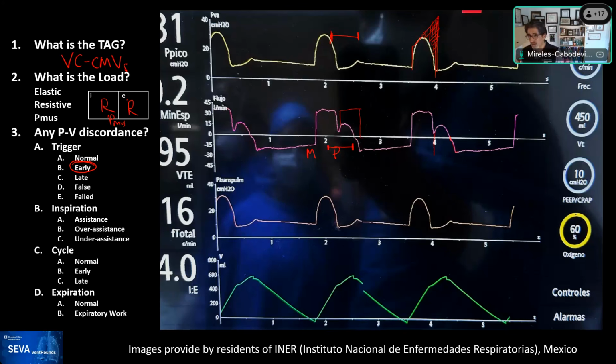Now, sometimes you cannot control this. The risk is too high. Maybe this patient has severe obstruction of the trachea or something along those lines, and the team is very concerned. And then sedation is the answer, right? So yes, depending on the goal, absolutely. But in general terms, if I see this, my first reaction, even if my goal is safety, if I have the ability to, I drop the rate. That's my usual first behavior. The level of evidence for this is mainly expert opinion and anecdotal, and based on what we know about this process. But that's how we do it.